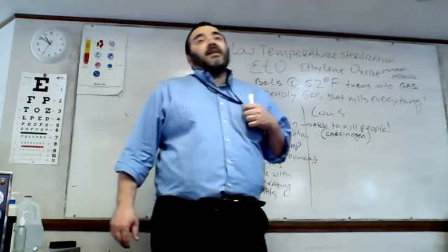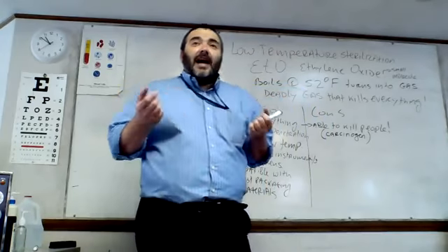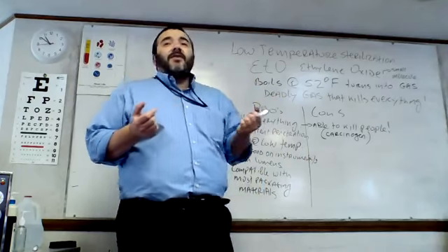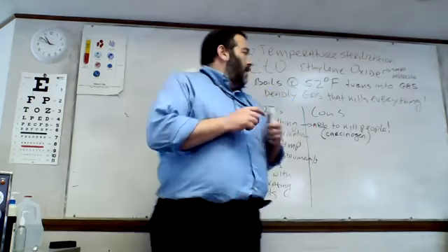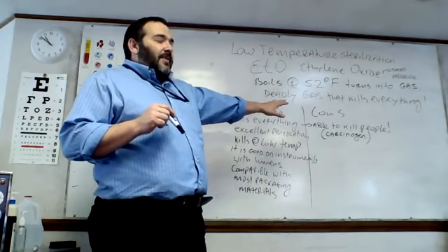A place like Mass Eye and Ear, for example, has it because it's sensitive, delicate eye instruments that may be corroded by steam, which are better off with ethylene oxide as a sterilant. Make sense? Okay, now, some of the other cons, and we'll come back to this.